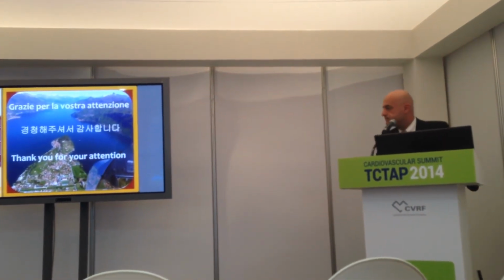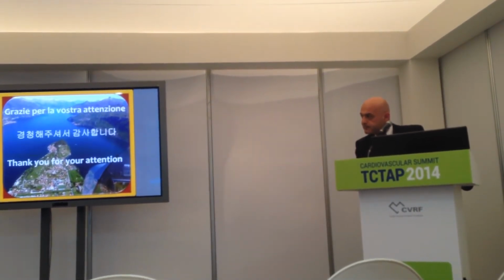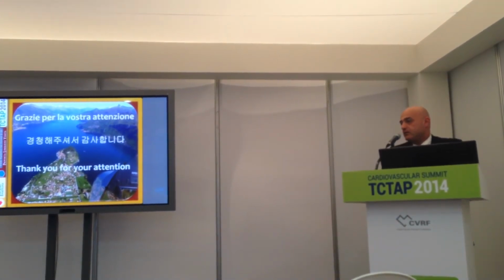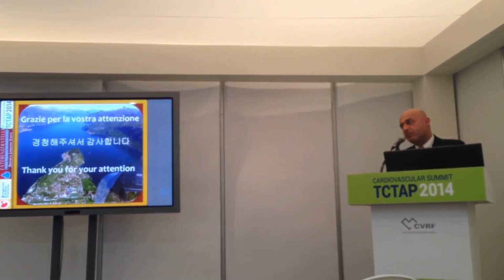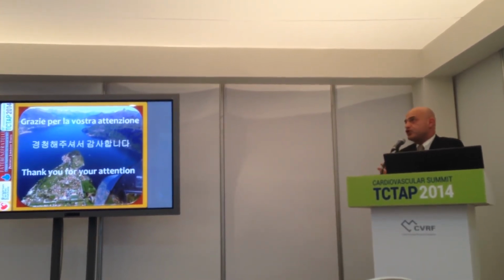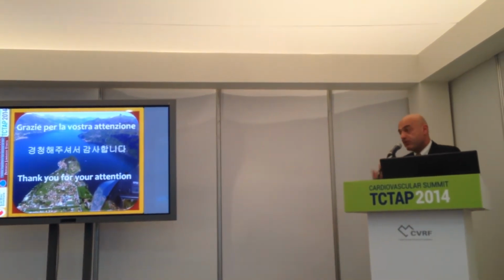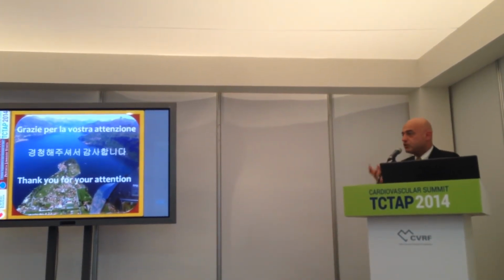I have one question: how many patients did you do post-dilatation after the stent? You mean post-dilatation? Yes. Well, I have to say that almost 80 or 90% of the patients I performed a post-dilatation, because now maybe less, now I have experience, but at the beginning you're not sure that the stent is open and covers the bifurcation. And I have to say that preparation is important, so we perform the preparation before the placing of the stent. Once you perform the preparation, you put the stent, you say, well, why not do a post-dilatation?